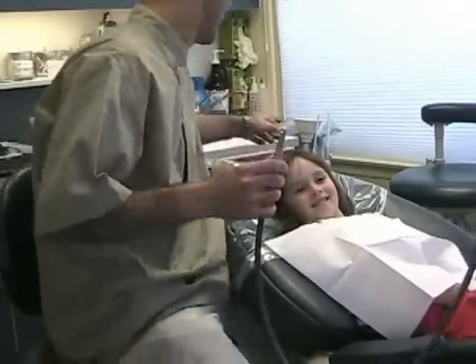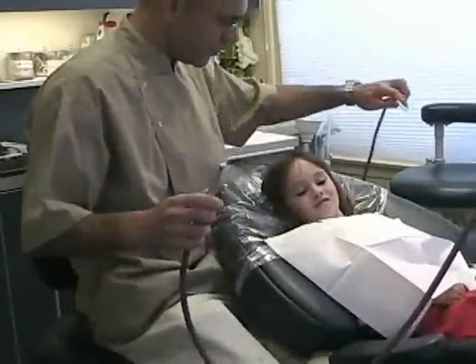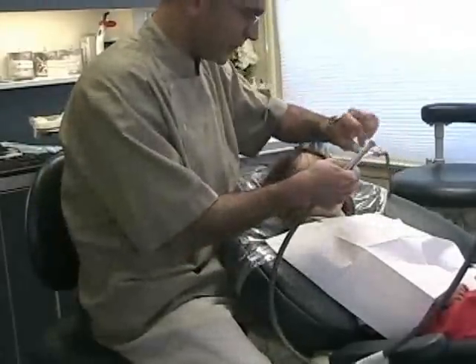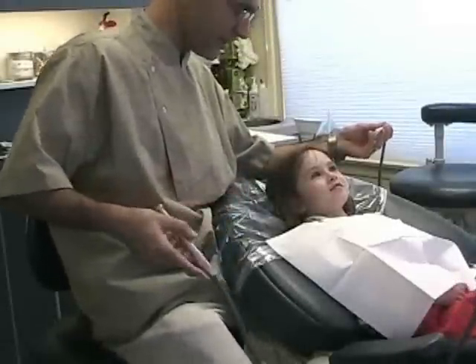And then we're going to have a little straw here that we'll put in your mouth and it'll suck away the water. Shall we try it? Yeah? Let's just try the water.